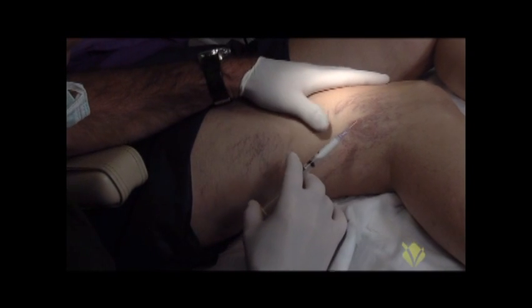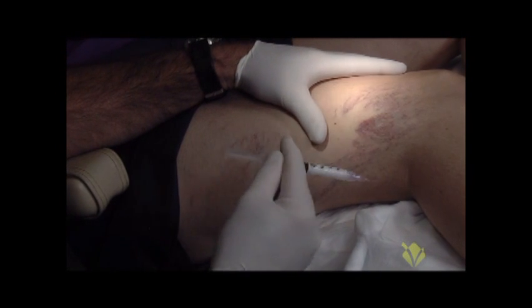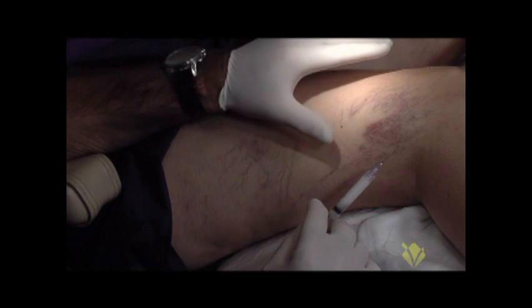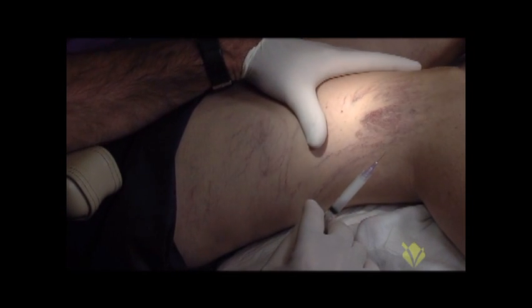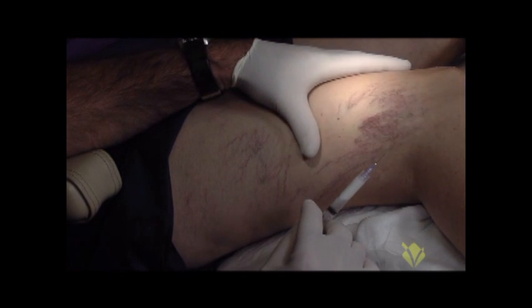Today we have the benefit of the lights for the filming of this, but typically I just use the Cirrus light with its polarized lens, and that gives me excellent visualization of the spiders, the telangiectasias, as well as the reticular veins underneath the skin.